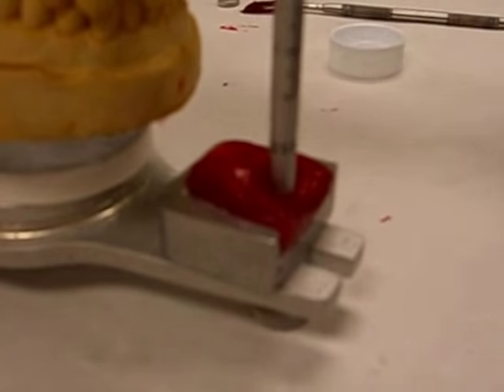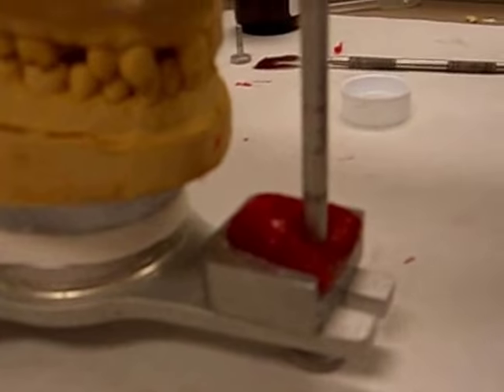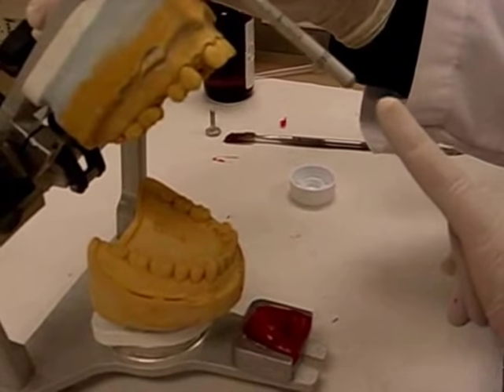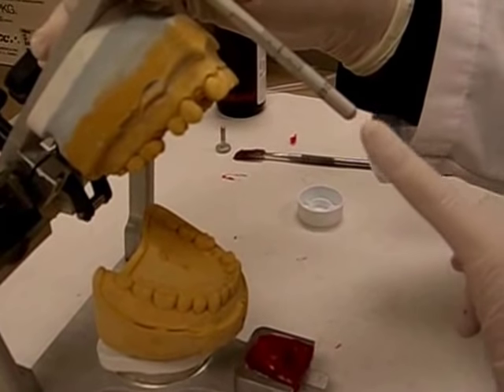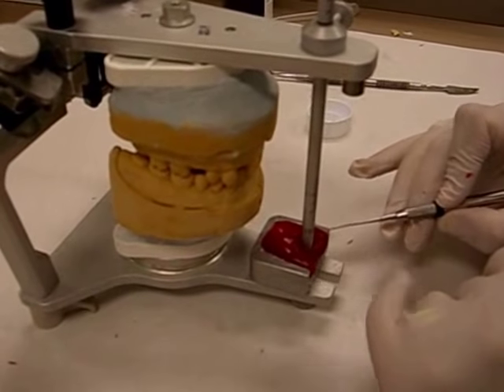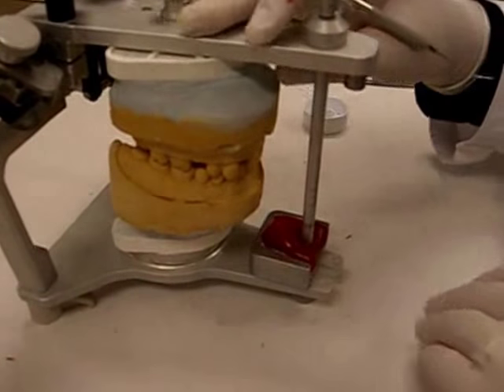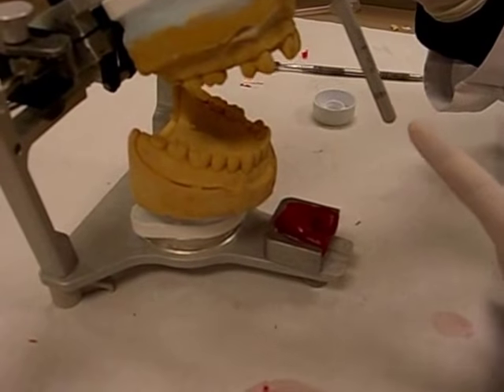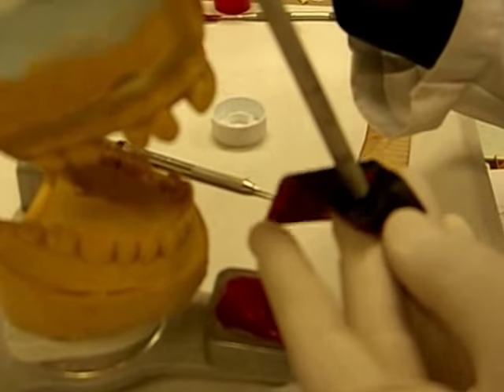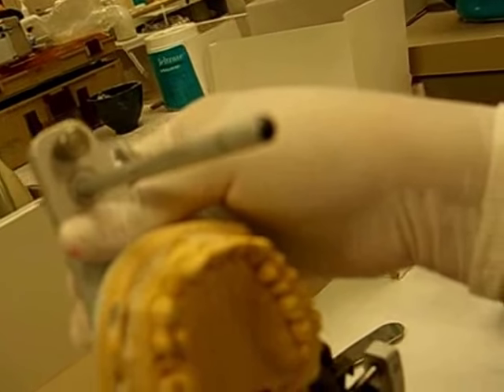If you want to confirm that your movements were recorded, you can also use articulating paper to stain a little bit and mark on the pin, then go back to it. You can also put the articulating paper on it, but then it becomes a little messy. To me, it's neater to use the articulating paper on the pin to get some of that black on it, and then you can record.